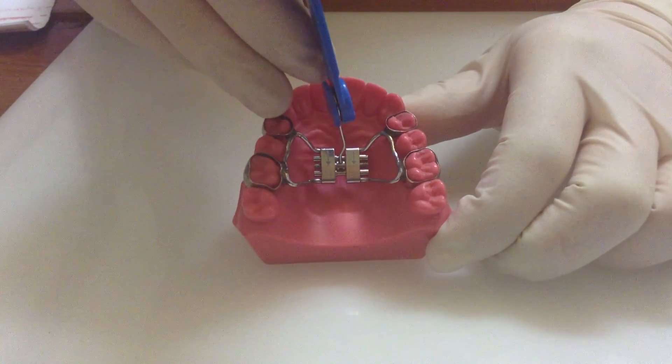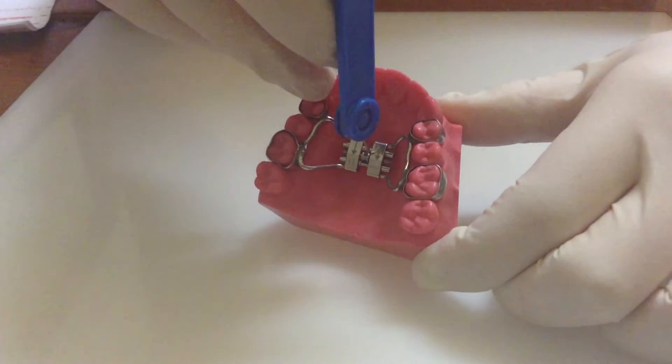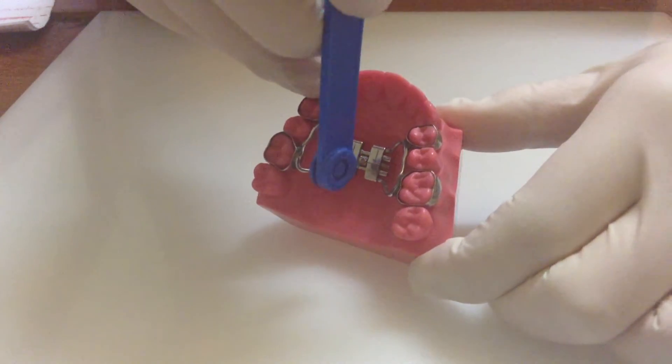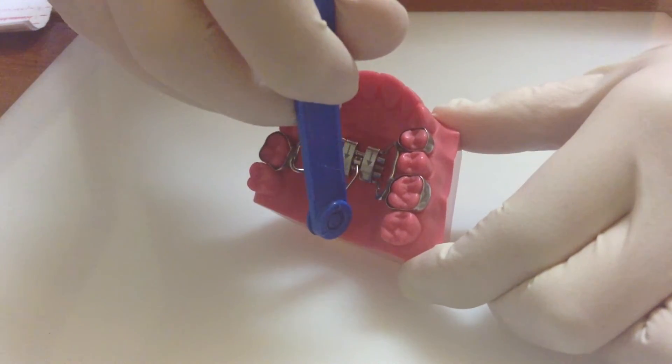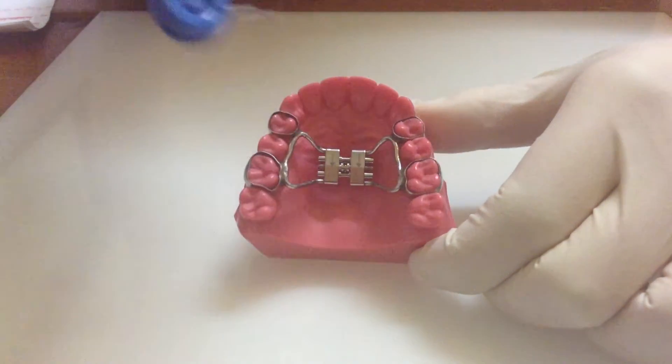There's a hole here that you put the key into, so it slots into that hole, and then you turn the key towards the back of the mouth — a full expansion — and then gently remove the key, just like that.